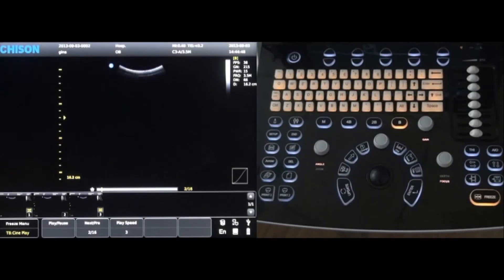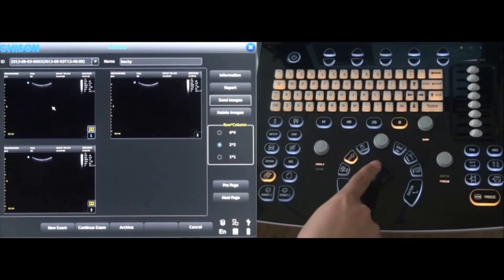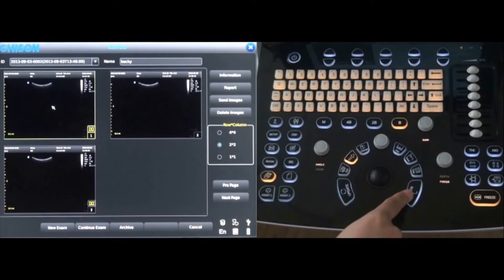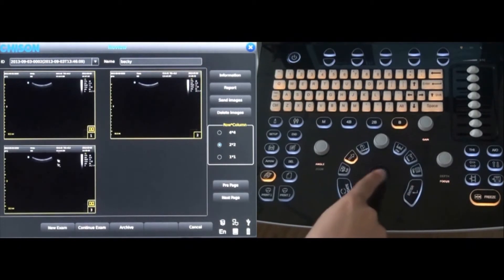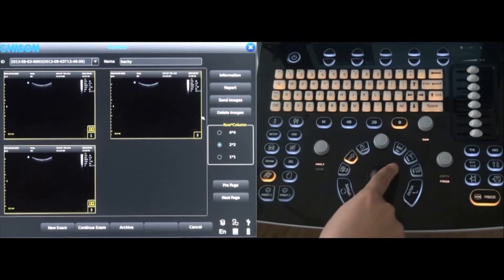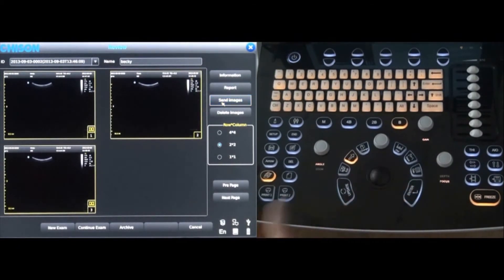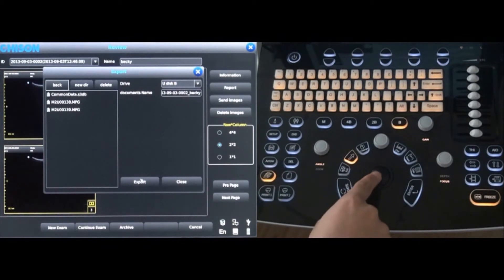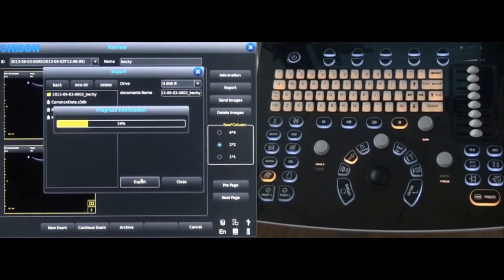Images can be reviewed by pressing the archive key, which is located to the left of the report key. Images can then be exported to a USB drive by first selecting the images and then selecting send images. Select export to complete the process.